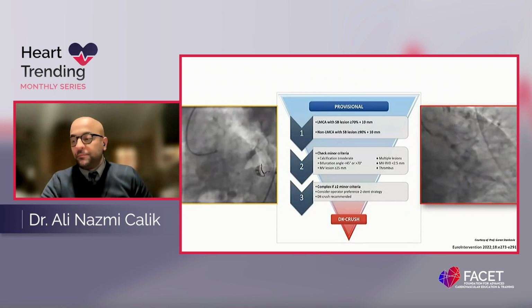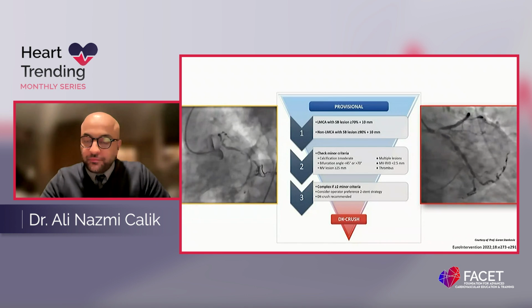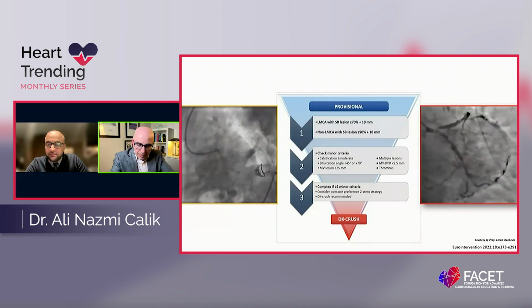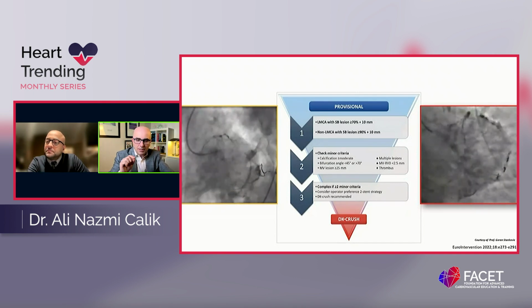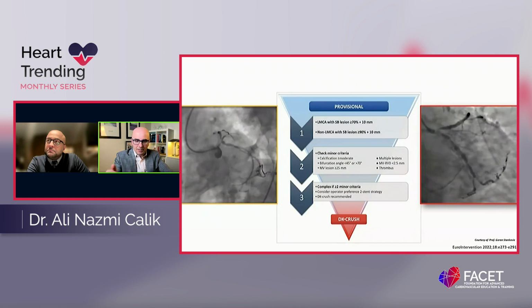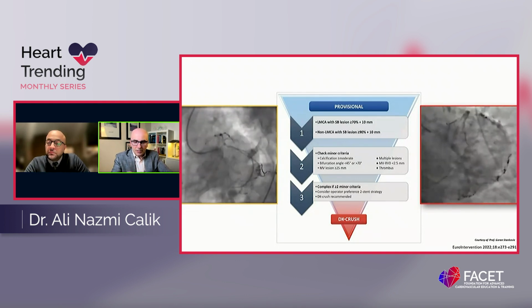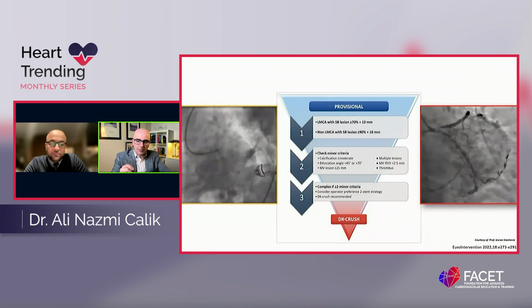I think it's nice to pause here, a lot of information came through. One of the comments is, so you mentioned that this is for DK crush. It's advised when you have a similar size of the distal main vessel. Here it's almost the same. It's a bifurcation lesion. And if you want to advise IVUS or any imaging tool, wouldn't you go for it because of specific calcification? Otherwise this becomes more of a visual estimate to plan the technique.